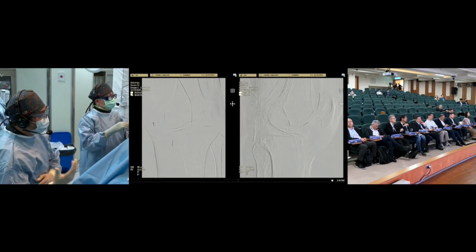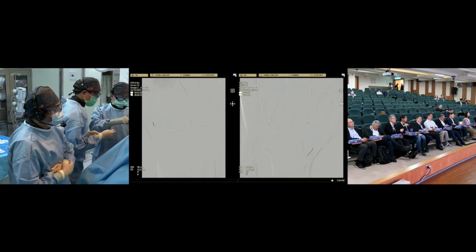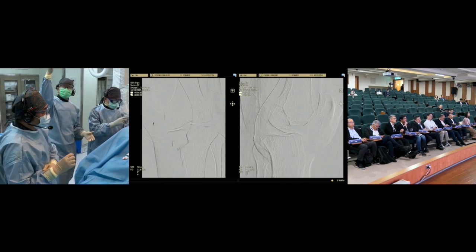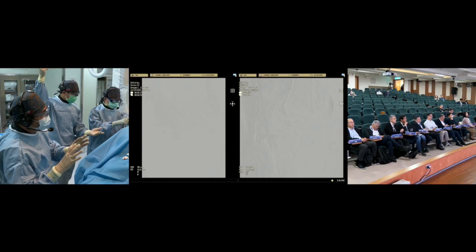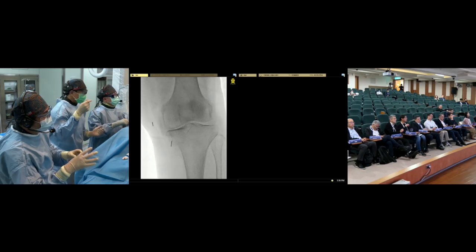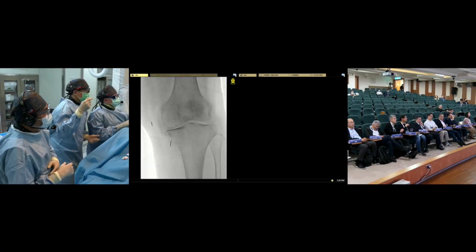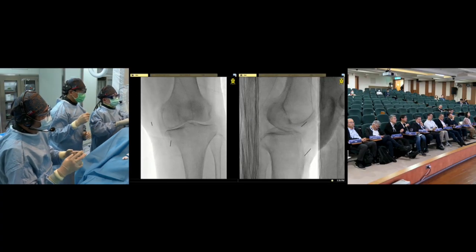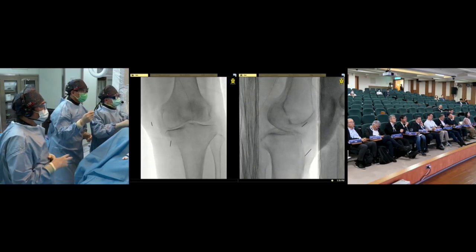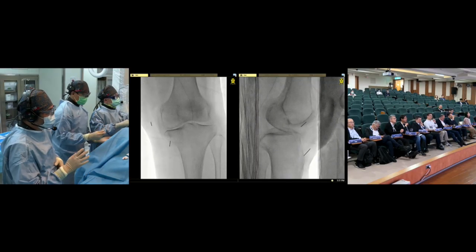Yeah, in my opinion, and that's Dr. Okuno's, the maximum amount is 2 cc per vessel if you use transient embolic agent. Sometimes you will see some new moya-like vessel. That is because you already embolized the bad one. Some angiogenesis is from the muscular branch or the soft tissue branch. So even if you see angiogenesis, don't do more than 2 cc per vessel. 2 cc is my maximum amount. Even if I see residual angiogenesis, I won't do further embolization.